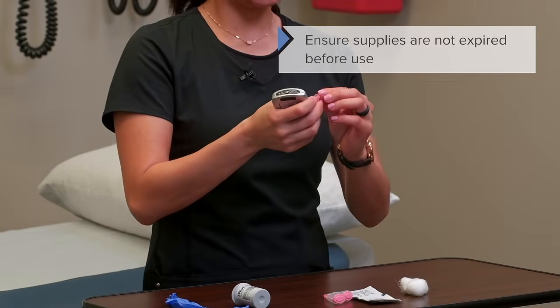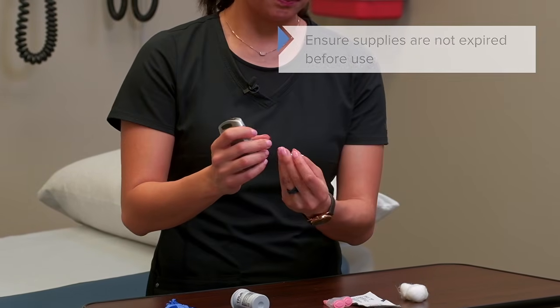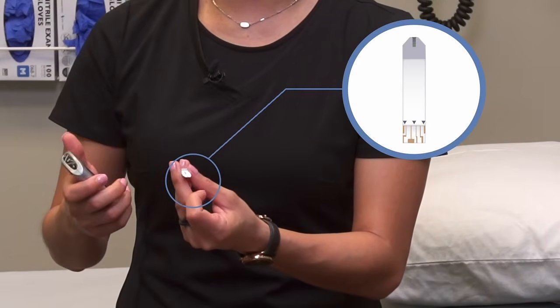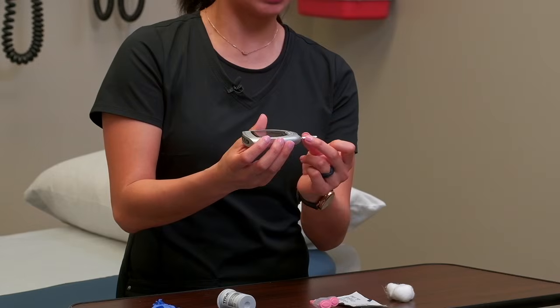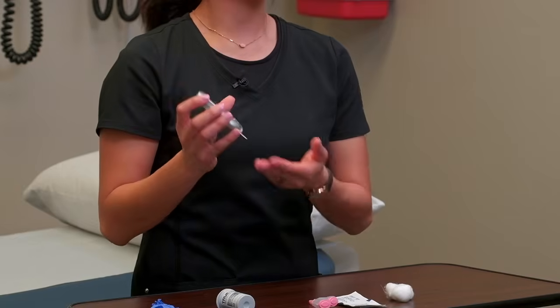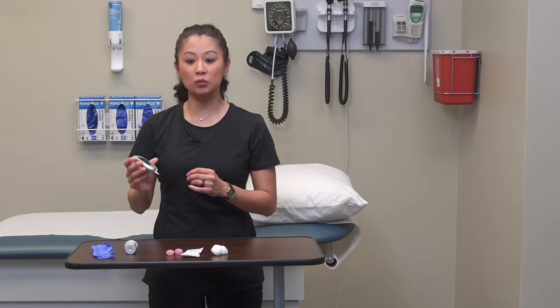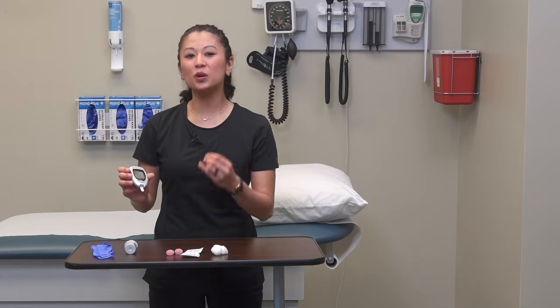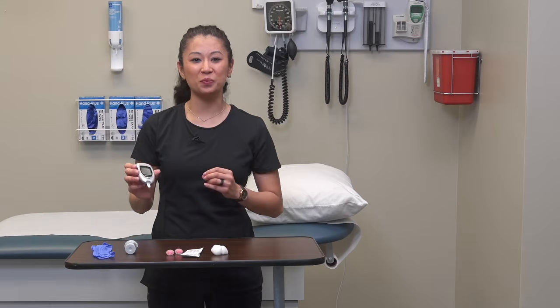So once we insert our strip, usually it's got the piece here where there's a little bitty gray box. That's what's going to fill up with blood. That's the piece that should point outwards. The other piece is what's going to slide in our meter itself. Now, when you slide the glucose strip in, it doesn't matter which type of meter you're going to use. It will recognize that there's a strip and it's ready to go. You'll also know it's ready by seeing this little drop of blood, and that's common on most meters.